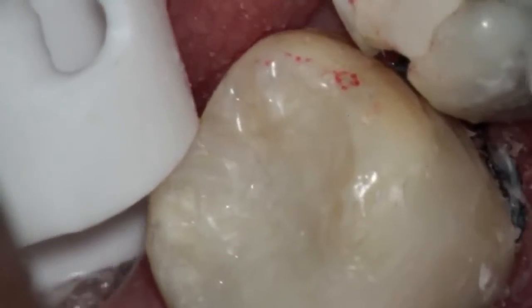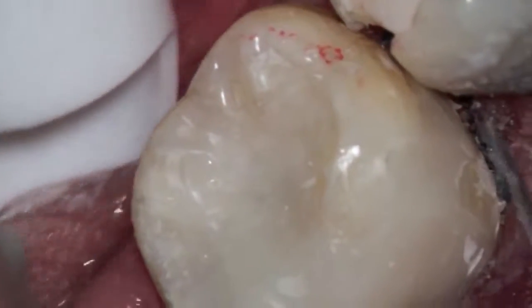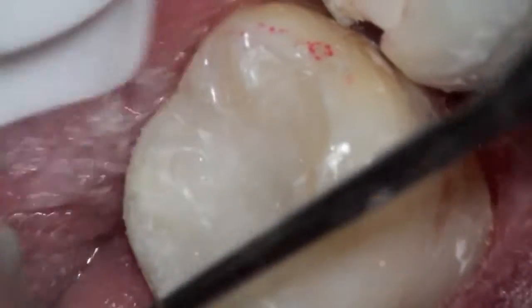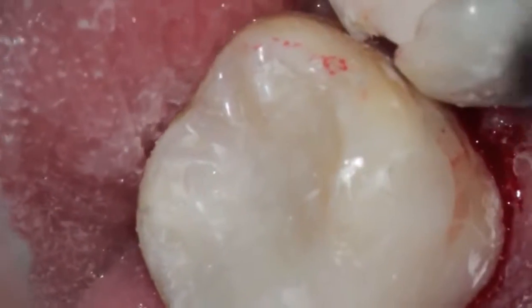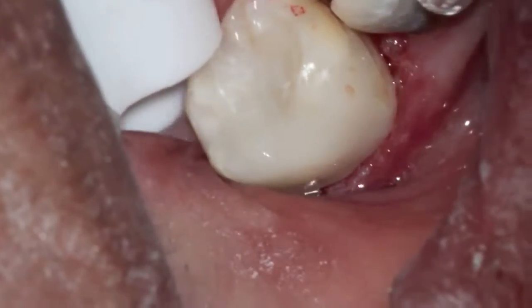When the person goes side to side, you really don't want any major placement of force on it. There's the interproximal area. We're taking out the cord that we had around the tooth, and that helped keep the gum tissue back. That was some number 1 cord, cleaning it up, and there's the filling.